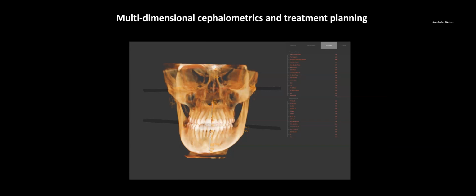In fact, I'm going to put a little plug for Osteoid. They have recently come out with the first and only automated cephalometric landmark identification process. All right. So that's really reducing the human error and time and effort in creating three-dimensional analysis, right? So it's part of their AI system, which is being automated. I don't know if that's out for release yet. Pardon me, I don't even know if I was supposed to talk about that, but it's very exciting.